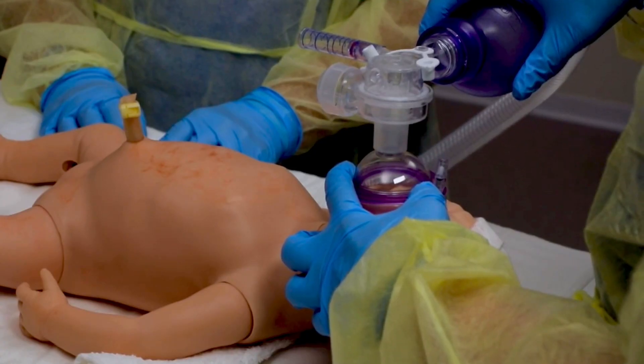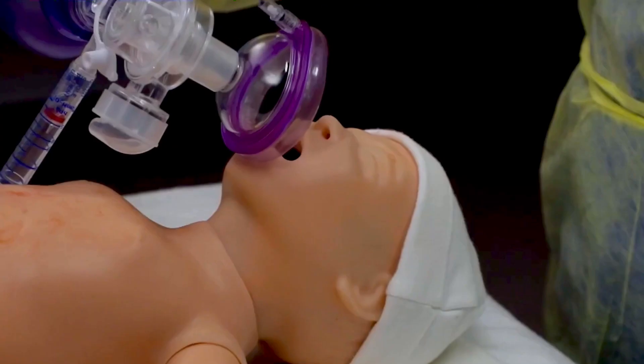Now that you've watched a slow demonstration of mask placement, watch in real time.